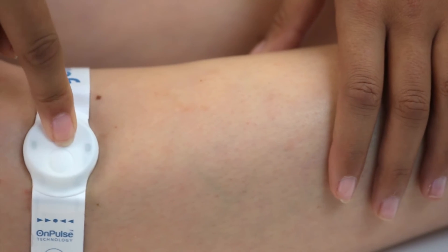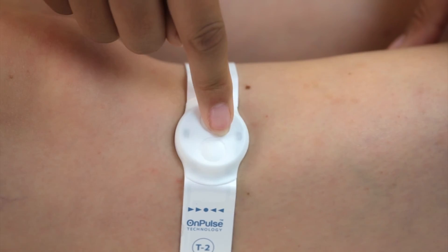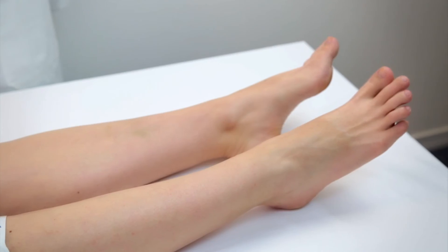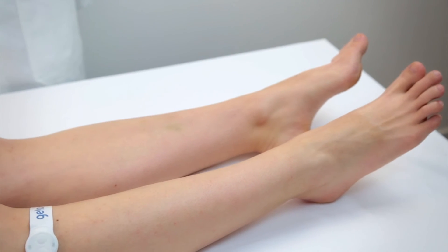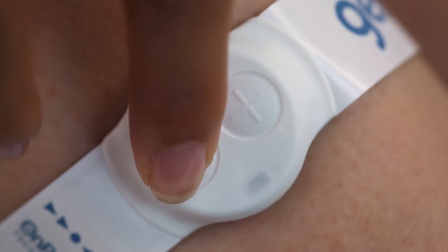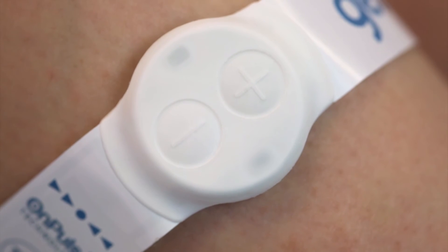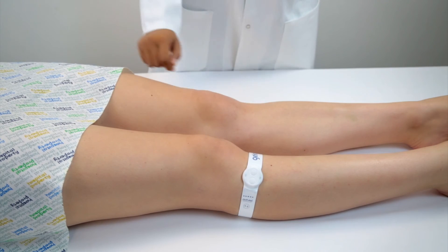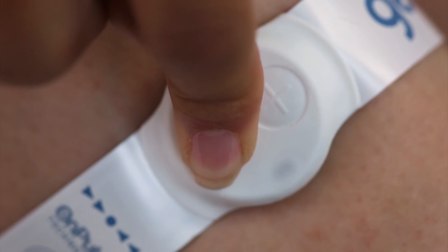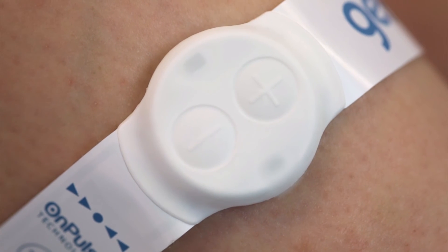There are seven stimulation levels in the GECKO T2. The settings are indicated by the number of flashes in sequence from the LED lights while the device is operating. In most cases, levels 3 or 4 are ideal. To reduce the levels one by one, use a short press of the minus button. To turn the device off completely, hold either the plus or minus button down for 3 to 4 seconds. Note that when the button is pressed, the LED light will flash rapidly to confirm its operation.